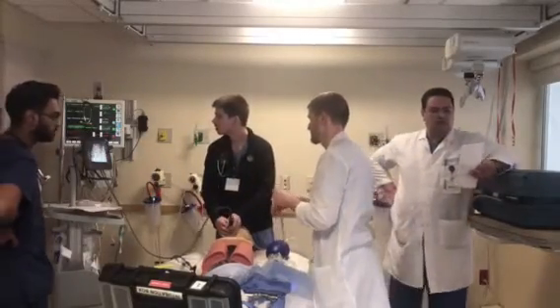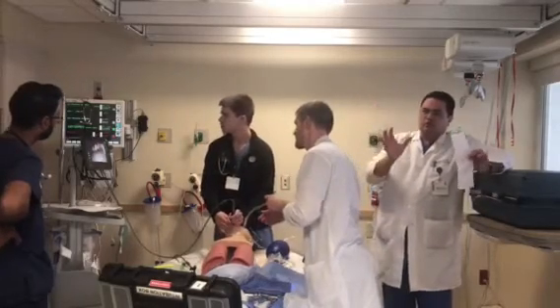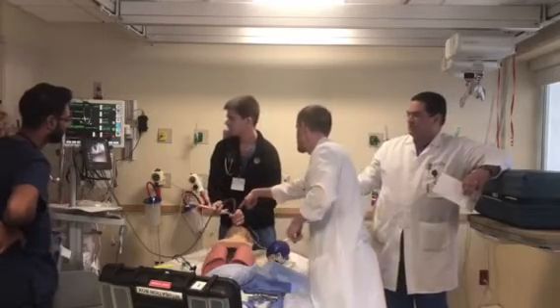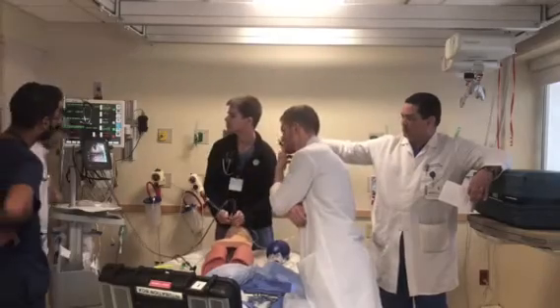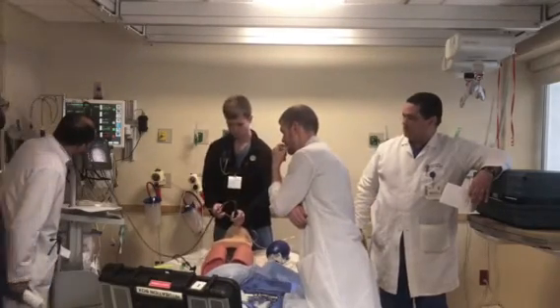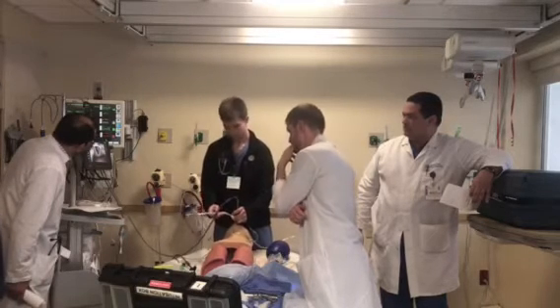All right, so that's exactly the same as what we've done before, but because we could ventilate the patient, we made the situation good, and now we can intubate. You can't do it like this until you see the epiglottis. Bring your scope out until you see the epiglottis. More, bring the scope out a little more. Yeah, push in now, yeah, that's the view that you want, right?